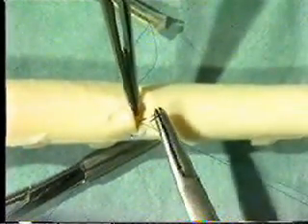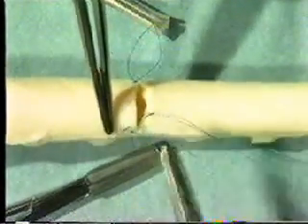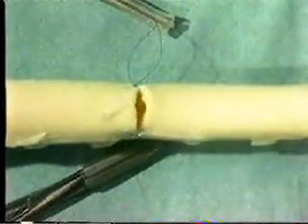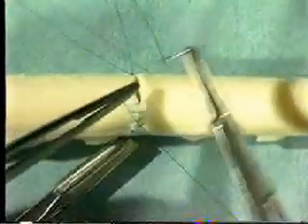It is essential that you have an assistant to follow the sutures to ensure that the correct tension is maintained. Continue until you reach the apex of the vessel, then start again at the far corner.